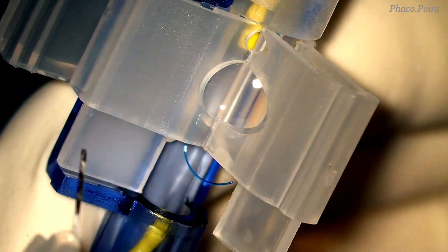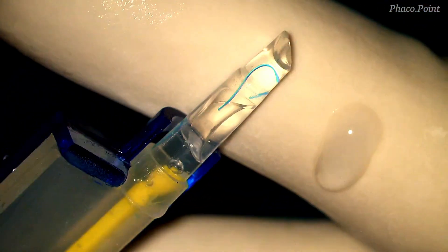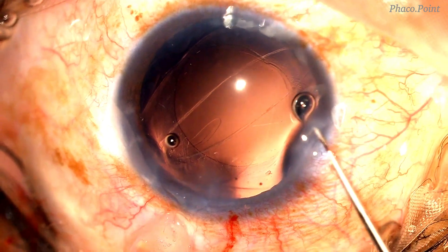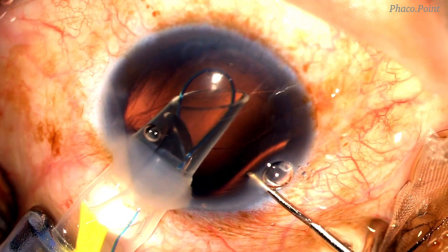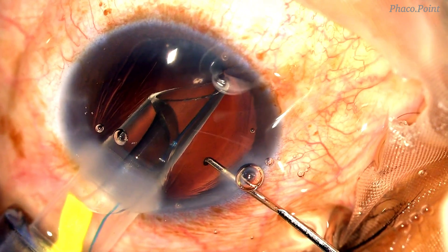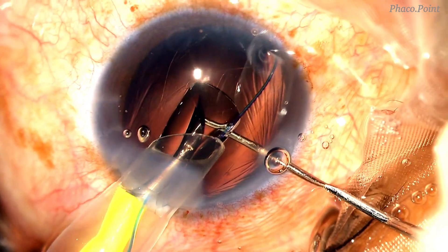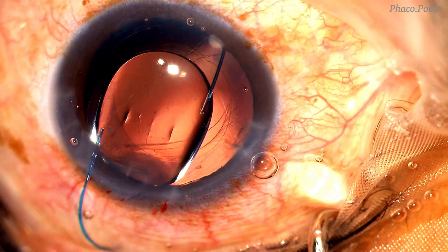We now proceed to the loading and insertion of the 3-piece IOL. Following introduction of viscoelastic within the nozzle of the cartridge and over the IOL, it is snapped shut and the plunger pushes the IOL anteriorly up to the tip of the nozzle. The orientation of the leading haptic is carefully observed. The nozzle of the cartridge is introduced well within the anterior chamber to enable the leading haptic to go comfortably into the ciliary sulcus. The optic is then injected into the anterior chamber and the nozzle withdrawn, leaving the trailing haptic out of the eye, which is stabilized with the second instrument.